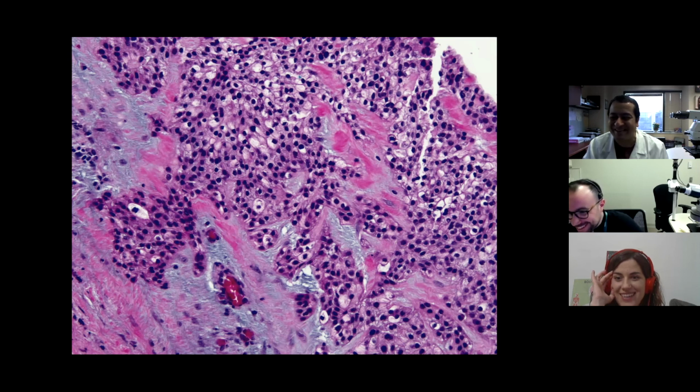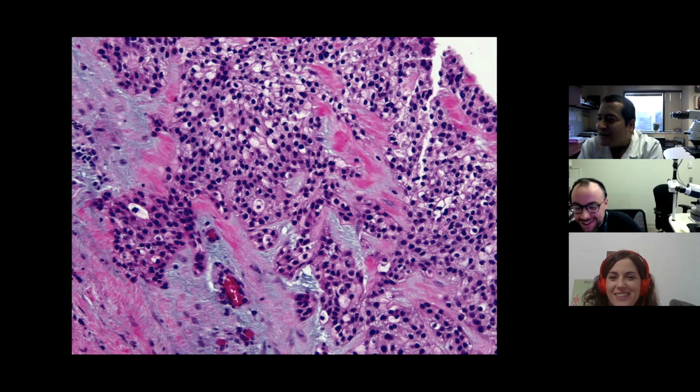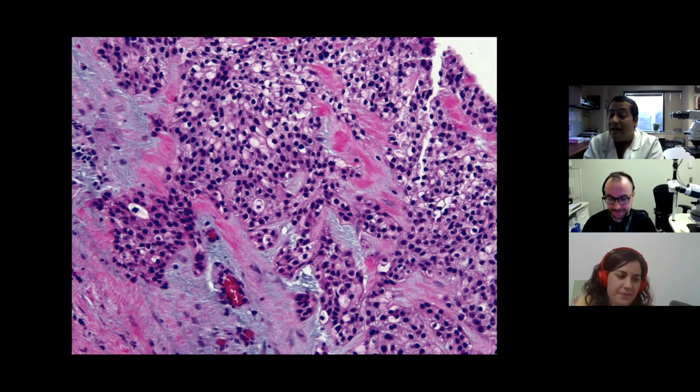So this is a clear cell carcinoma, or what used to be called hyalinizing clear cell carcinoma. Which is not a good case for a spotter because it's exceedingly rare in the lung. It's very, very rare to have a lung primary hyalinizing clear cell carcinoma. But the teaching point is that the immunophenotype is the same as that of squamous cell carcinoma.